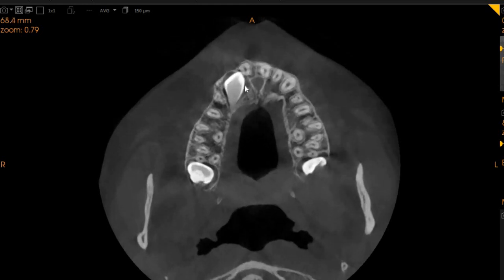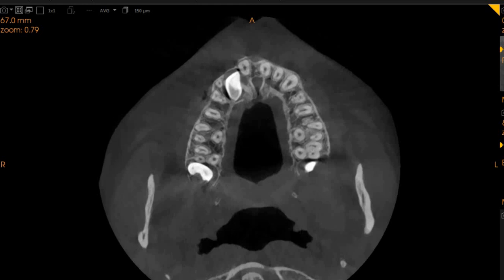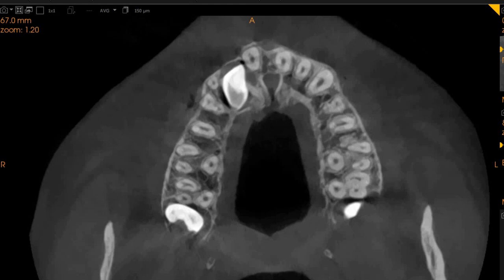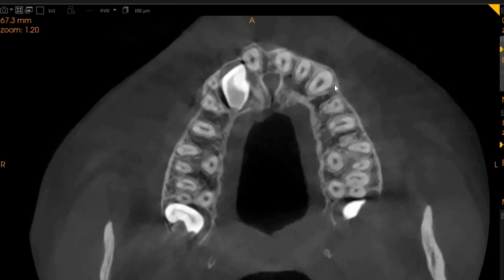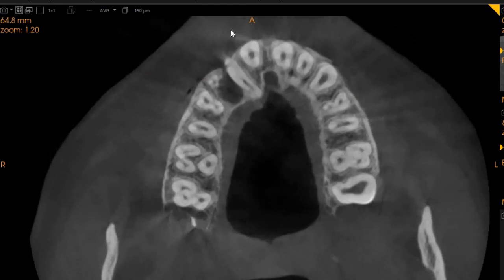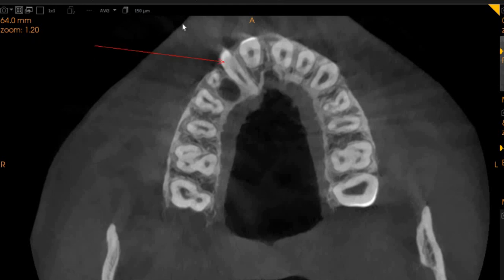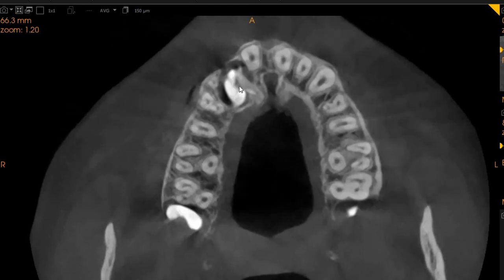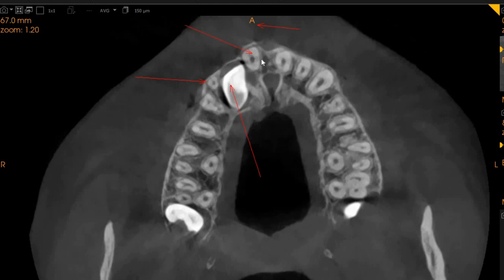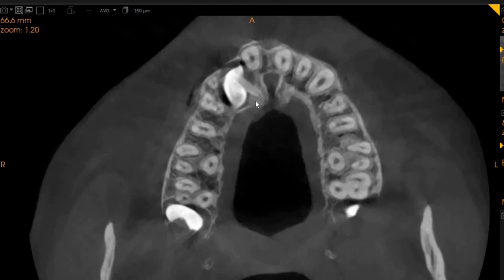As we are moving apically, we will begin to see the permanent canine and its roots. This is the deciduous canine, and this is the permanent canine. This is the central incisor. As we move more superficially, this is the lateral incisor, which is placed horizontally — central incisor, lateral incisor, deciduous canine. And as we move superficially, you will see the permanent canine. This is the deciduous canine, this is the central incisor. This is the root of the lateral incisor, which is right next to it.